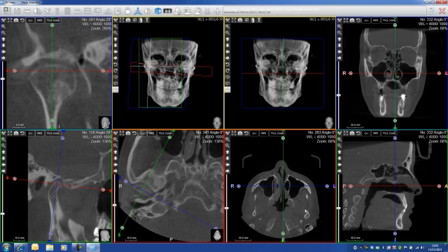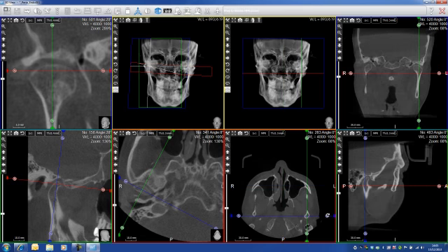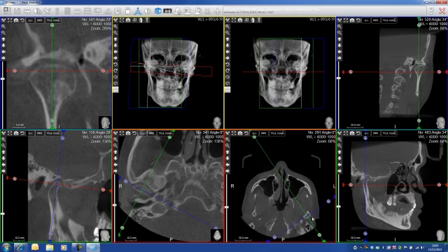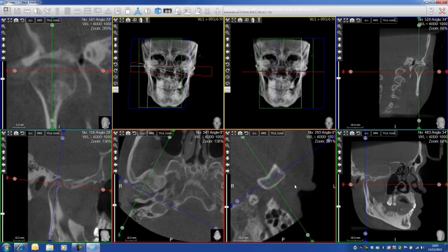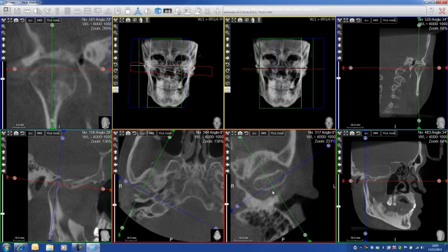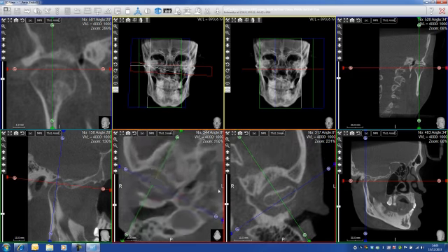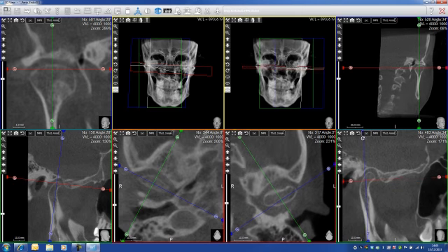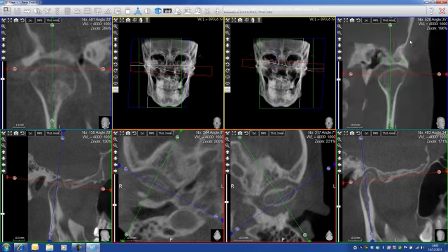Now I do the same thing for the left TMJ. I go here, I angulate, I can roll a little bit, and I zoom to see a bit more. The idea is to have exactly the same view as the right side. I zoom a little bit more, the TMJ is appearing now. I angulate this view a bit, and I can see my condyles.